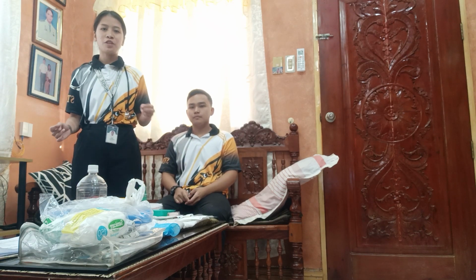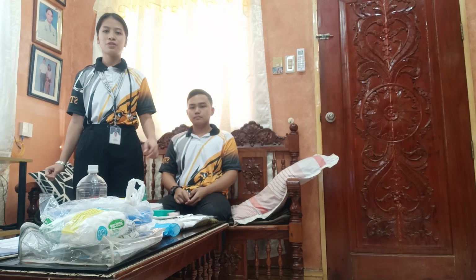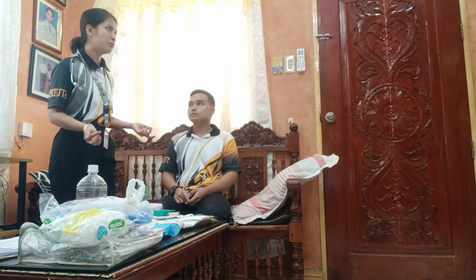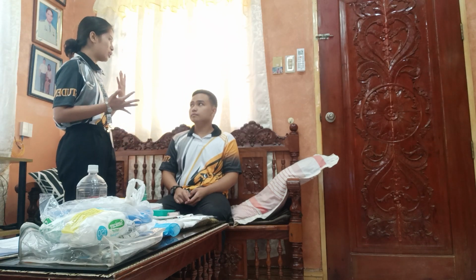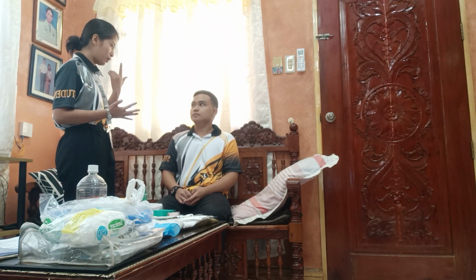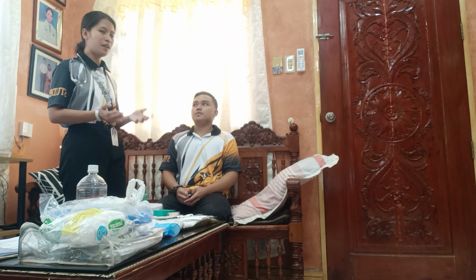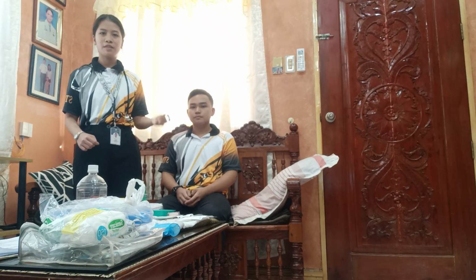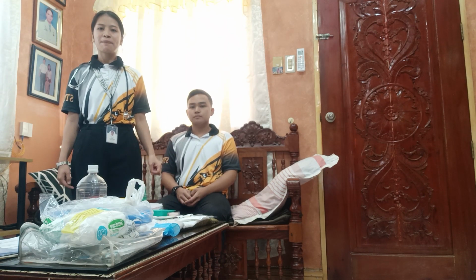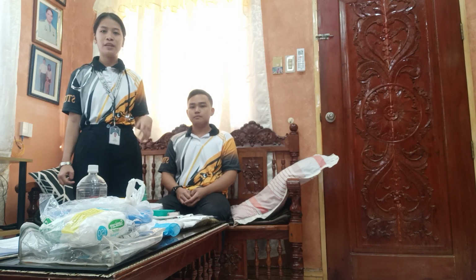And also assess the patient's history for any recent facial trauma, polyps, blockage, or surgeries. Sir, nagkaroon po ba or na-accident po ba kayo or tumama po yung face niyo po? Ganun? Or bukol po sa ilong po? Okay po. And any surgery po wala kayo? Hindi po. Okay, thank you po. And patients with facial fractures or facial surgeries present a higher risk for misplacement of the tube into the brain.